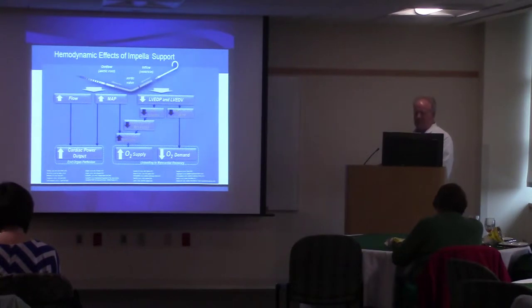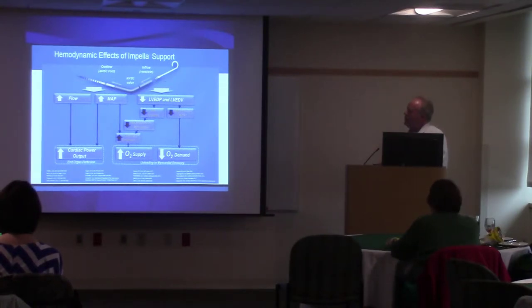So these are the effects from the Impella device. So again, it takes some blood here and injects it out into the body, and this allows us to increase the flow to the body. Okay, so it actually enhances the normal pumping action of the heart, so we can essentially double the flow that goes out to your body by using this pump.